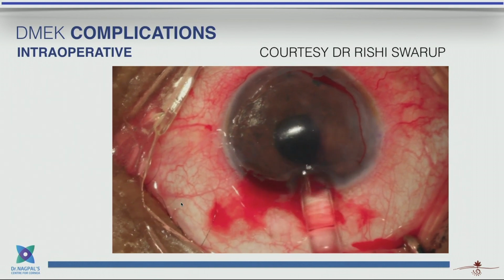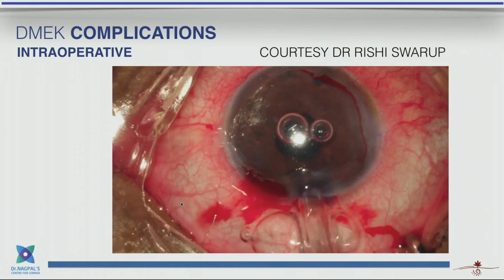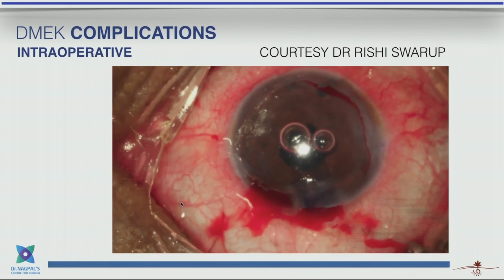I think Rishi, you can add your perspective to it. What happened actually? In this particular case, I did all the things. I pressed the wound as I was withdrawing the cannula, but in spite of that, it came and got stuck.